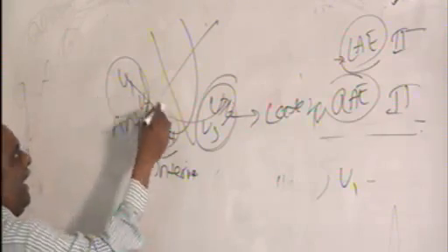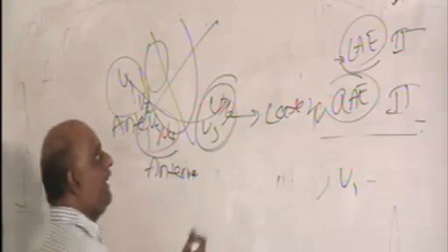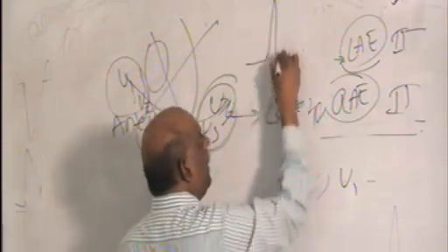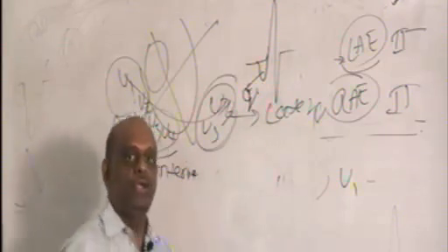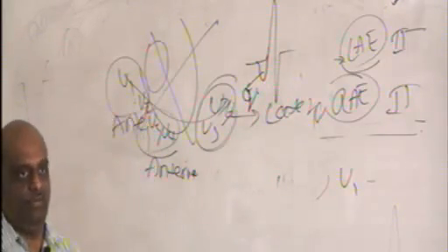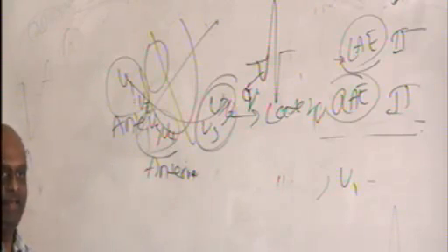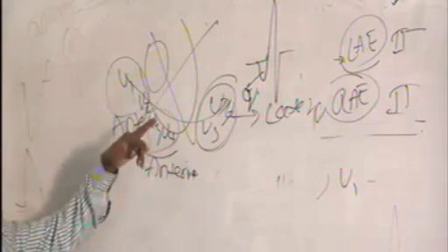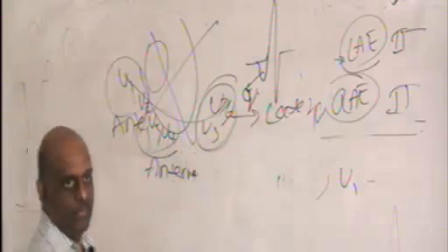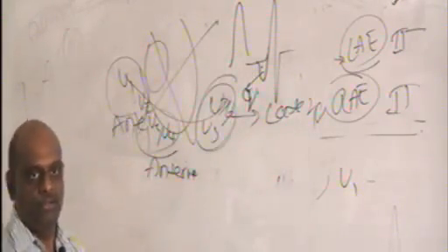So if you get a heart attack in the anterior aspect of the heart, how will it reflect? Before the R wave, there is a negative wave which is basically called Q wave. But if the posterior wall gets MI, you can't see Q wave because there is no posterior lead. But what is the reciprocal of Q? Q is negative. What is the reciprocal of Q?